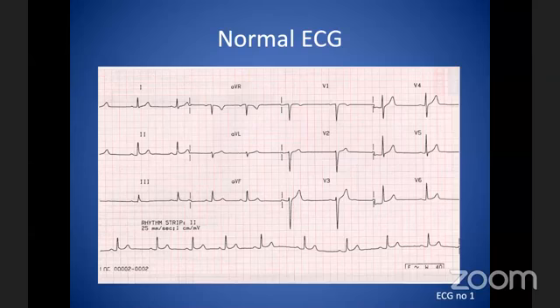So these are the basic things, and then you will look at T waves. Make sure they're upright where they're meant to be. You look at QRS complexes. You will look at ST segments. Okay, let me take you through this. So the first thing here, let's assume it's the right patient, the right label. Make sure the calibration is correct, but let's assume for the rest of the talk, all calibrations are correct.